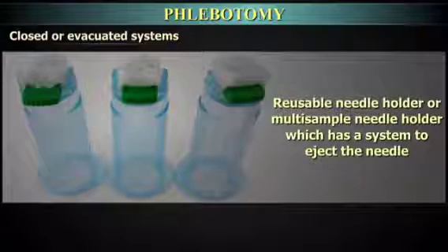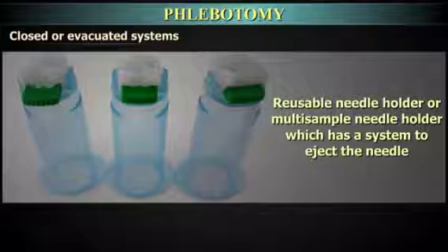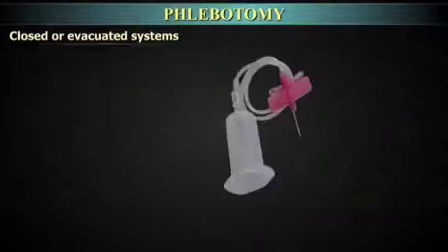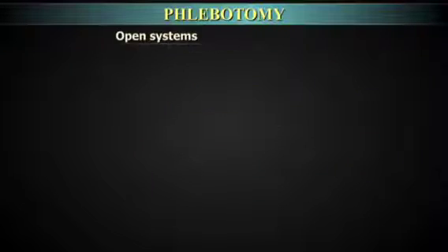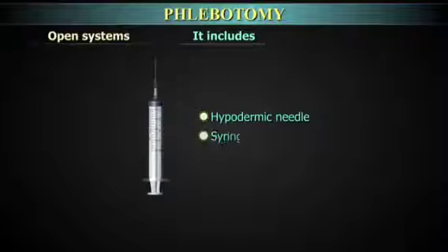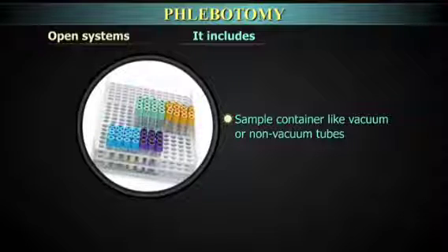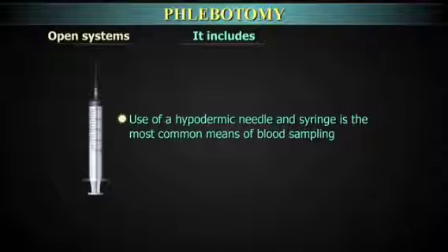However, there is also an option of using a reusable needle holder or a multi-sample needle holder which has a system to eject the needle after use. The evacuated systems may also be used with a winged butterfly needle and luer lock connectors. Open systems include hypodermic needle and syringes and sample container, which could be vacuum tubes or non-vacuum tubes. The use of a hypodermic needle and syringe is the most common means of blood sampling.